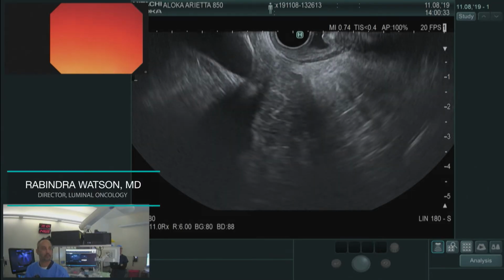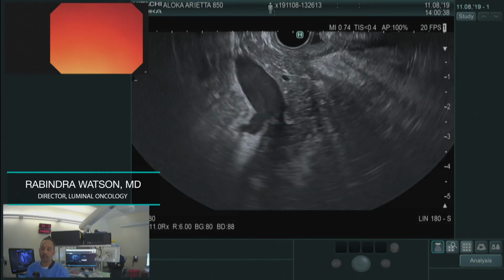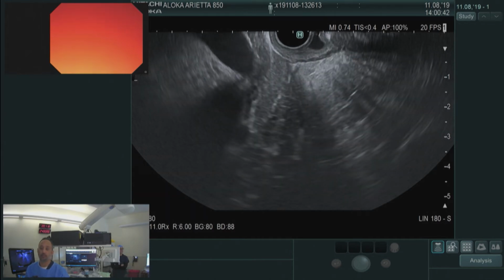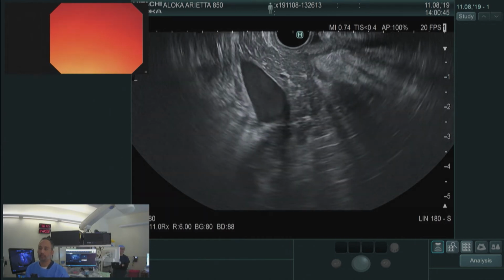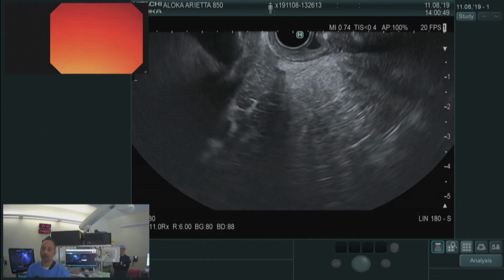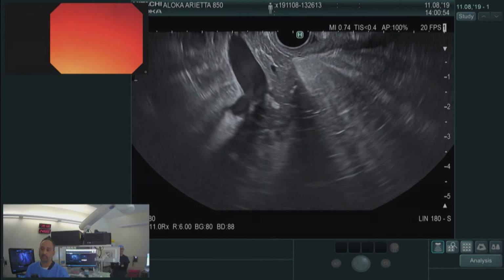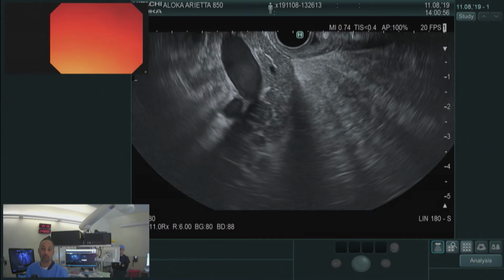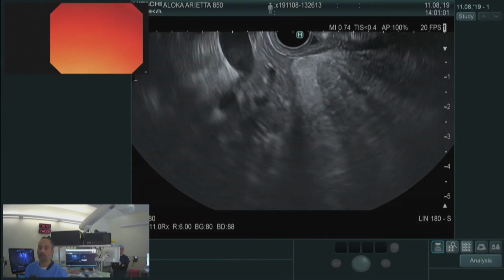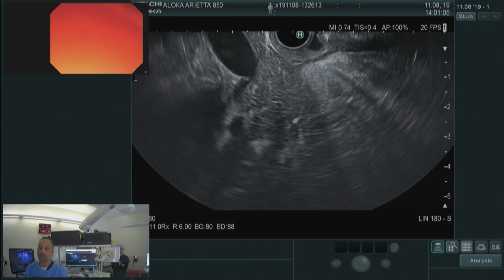Guys, thanks for the case introduction. So you see from the history, this is a pretty complex case. This is something we touched on for those of you who had the chance to come to our Axio Symposium in terms of patient selection. So this guy was initially referred to us about a week ago, and then we identified that splenic aneurysm and some development of blood products. So obviously we deferred on doing the endoscopic drainage, and we asked our IR colleagues to embolize the aneurysm, and you can see it quite nicely on those CT images.